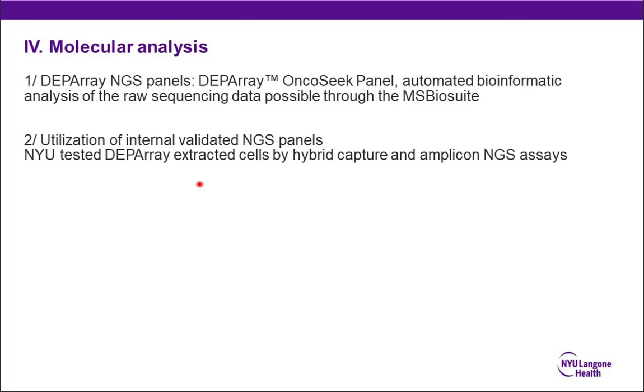So can you use it? We tested DEPArray extracted cells by 2 clinical panels, our hybrid capture chemistry, as well as an amplicon NGS assay. I'm going to show you examples of one of them.